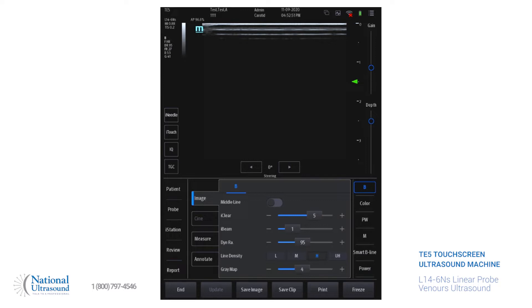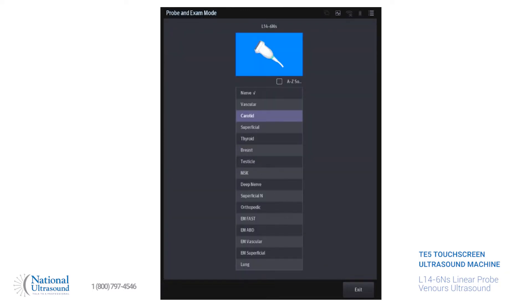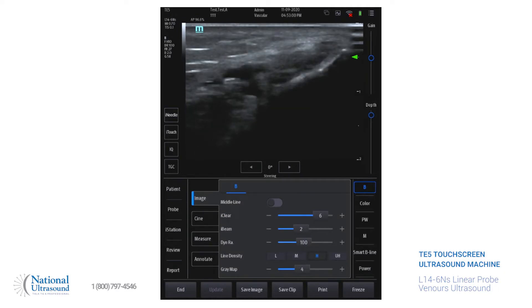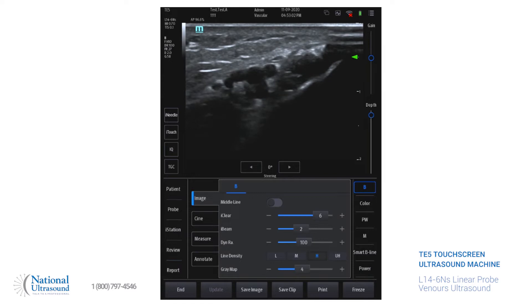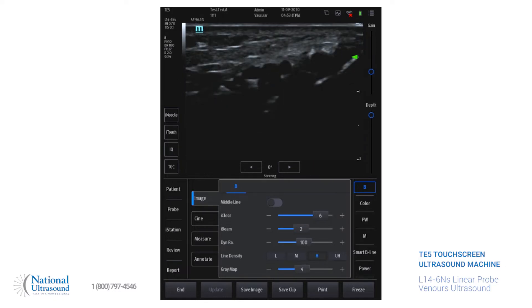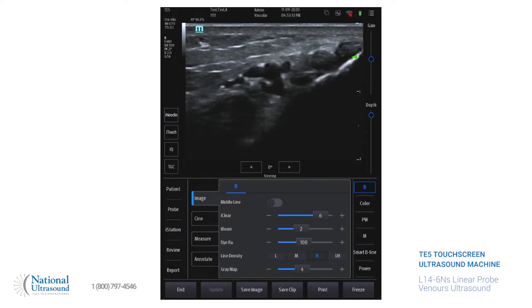I already have all the patient information entered, so we're going to get a probe and make sure that we're on the vascular setting. The depth and the gain are on the right side of the screen — you can adjust it by moving it up or down. For the posterior tibial veins, they're pretty superficial, so this depth is fine. For the gain, it actually is fine as is, but you can make it darker or lighter depending on your preference.